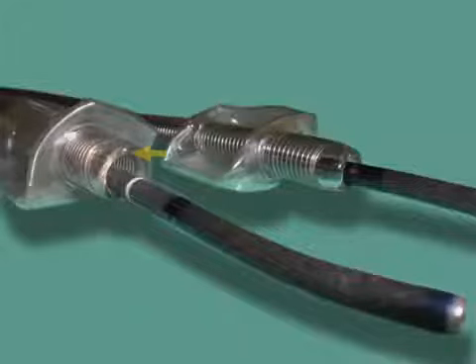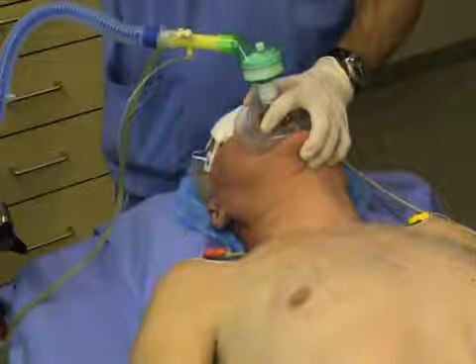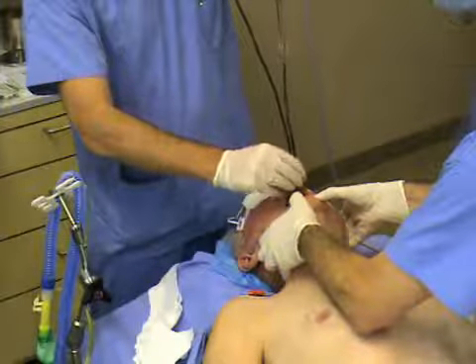It is very important to minimize the gap between the tube and the fibroscope, since a small gap decreases the likelihood of difficulty when advancing the tube over the fibroscope, especially in the posterior arytenoid region. When performing oral fiberoptic intubation, be sure that the chin lift and jaw thrust maneuver is adequate and be certain that the slit oral airway is the right size. In general, for adults, a number 4 slit airway is the appropriate size. If the oral airway is too large, it will obstruct your view through the fibroscope as you advance towards the glottis.